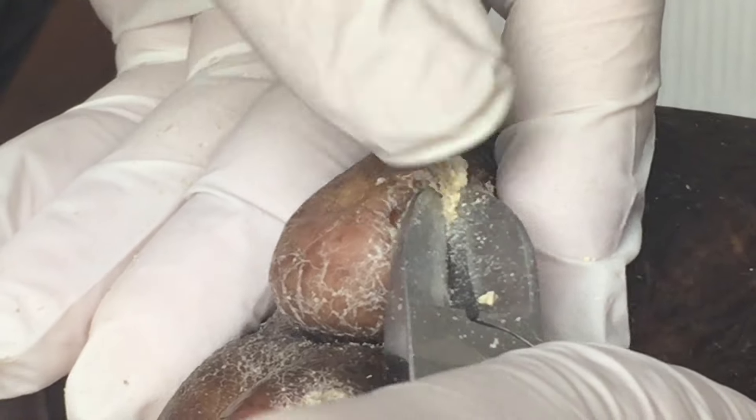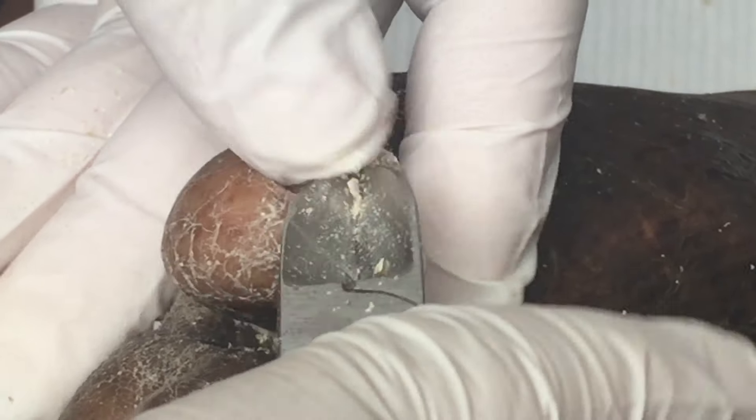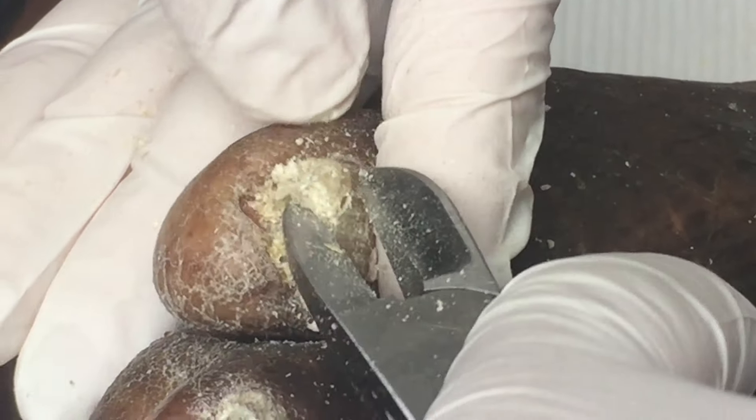So that nail was digging in pretty deep, so I'm glad he came in when he did. That could have ended up in a bad infection as well. So we're just working on the thickness in this corner of this nail here.